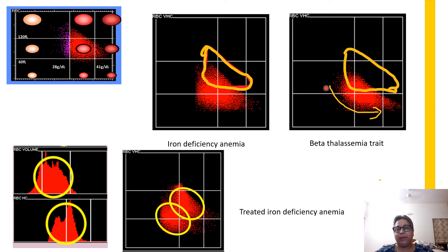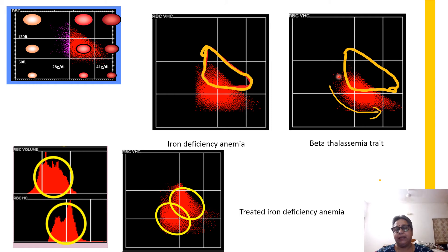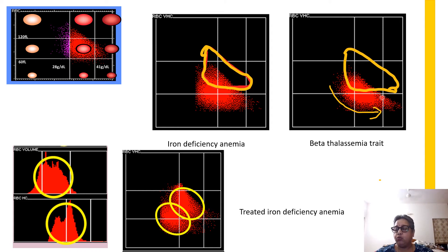Now if we look at the scatter side by side — this is the normal. You will have seen this erythrogram so many times now that you know the normal sits here. In iron deficiency anemia, it goes to the left and it goes below. Whereas in beta thalassemia trait, we have what is called a comma sign, where it is nicely curved. So the scatter of iron deficiency is different from the scatter of beta thalassemia trait. When you keep looking at these pictures, you will be able to note the subtle differences and differentiate an iron deficiency anemia from a beta thalassemia trait — the two most common differentials of microcytic hypochromic anemia.